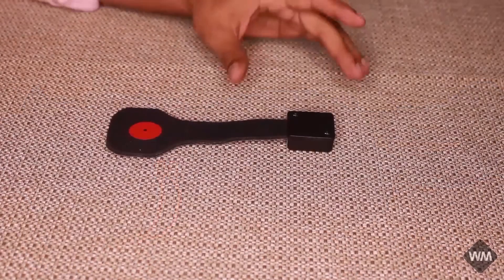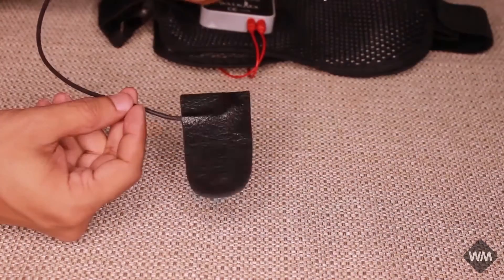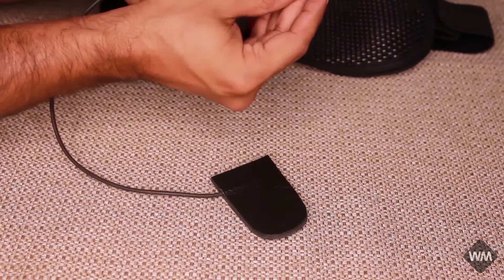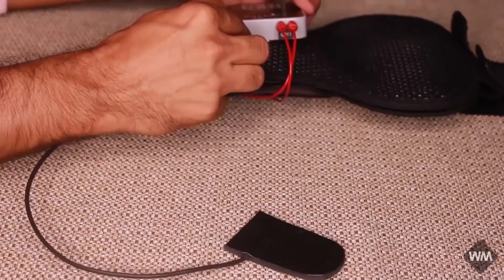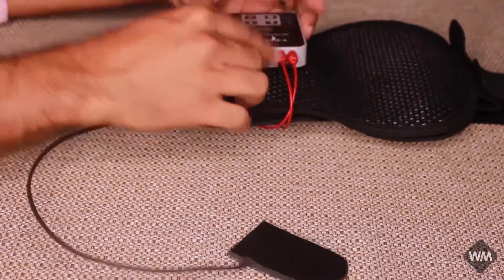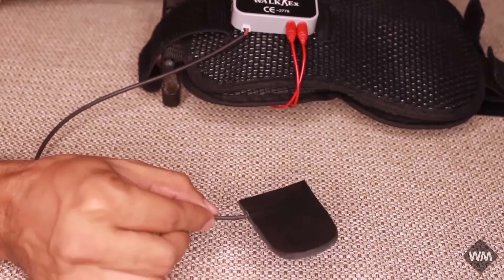This is the wireless foot sensor which goes under the heel of the patient's leg. This is the wired foot sensor and it is connected at the white connector. This part goes under the heel of the patient.